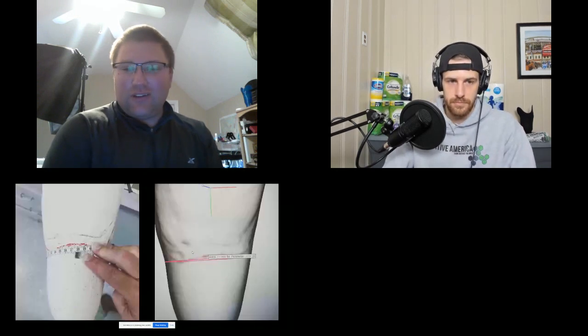But he's using his finger. It's staying in place, and he's a super talented classical guitar player and really liked it. So is Digiscan 3D enough along with the structure sensor? I would say yes. But I know we've got some engineers on this broadcast here, and so I just wanted to give you some numbers as well.